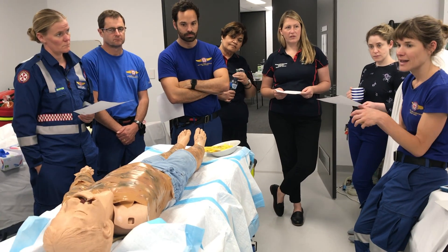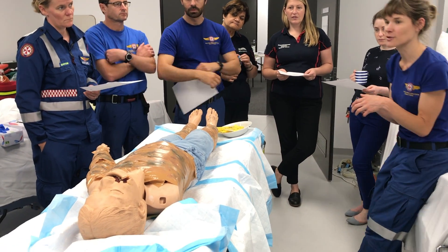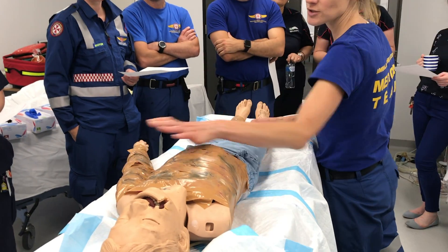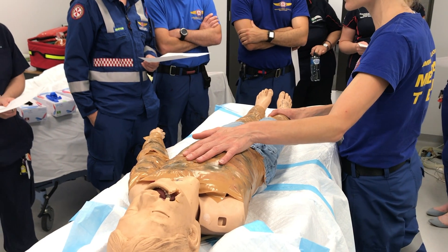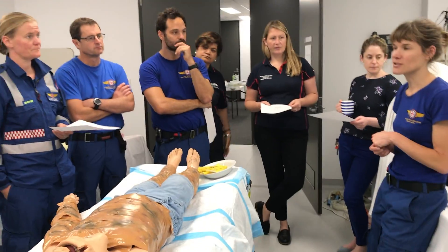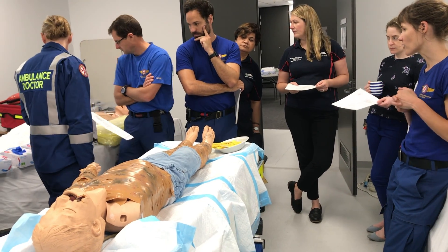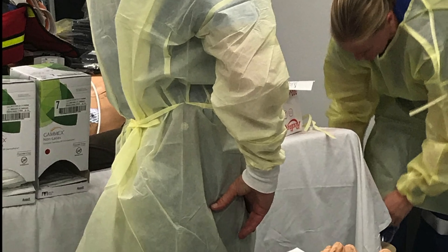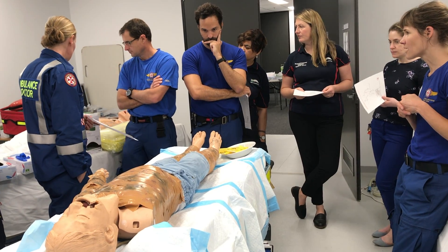We've got a model here that we can all have a practice on. There are two lower limbs and an upper limb — though he's missing his upper. We can have a go at the chest as well. Think about your own PPE for doing it — we've got some here. Everyone can have a go.